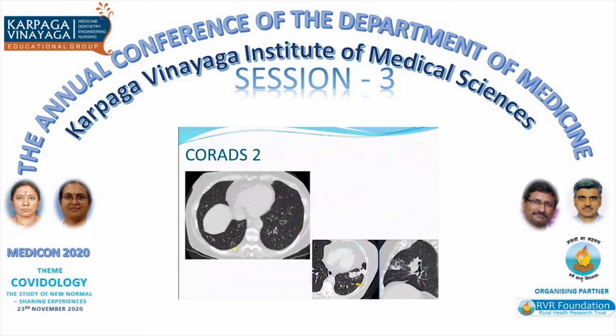So we know that it is just a small infection, not a CORADS. Whereas these are unilateral and a dense consolidation. This is a chronic organizing pneumonia, COP, what we call it, and not a COVID. So we call this CORADS 2, and very low level of any CORADS infection.